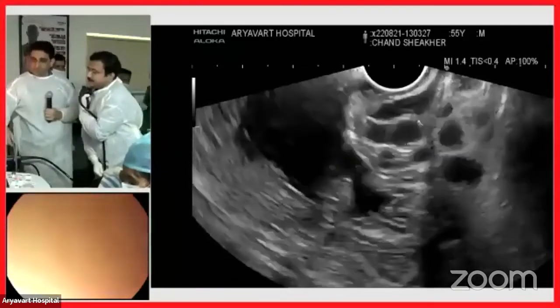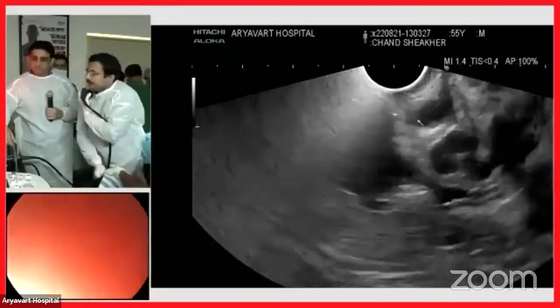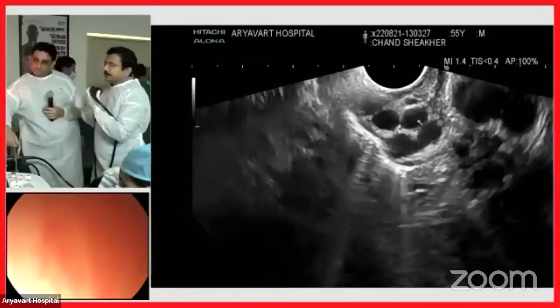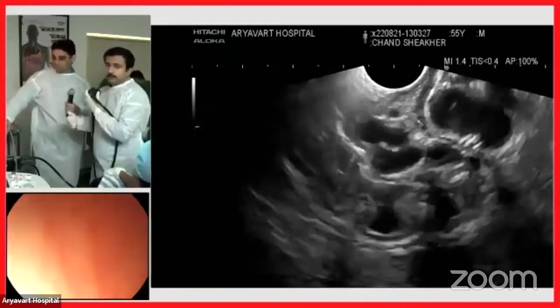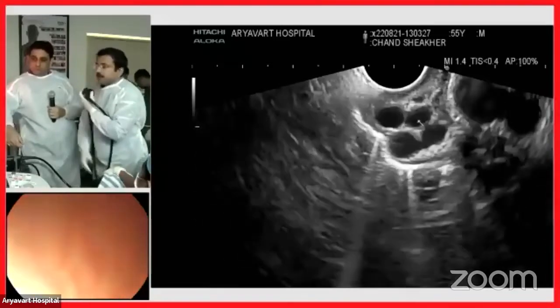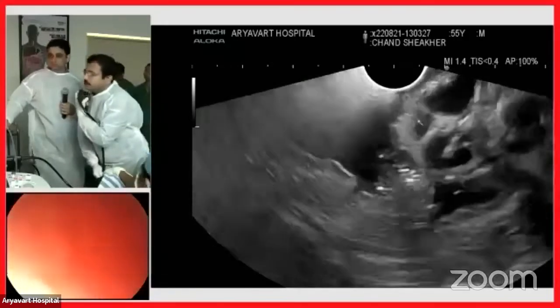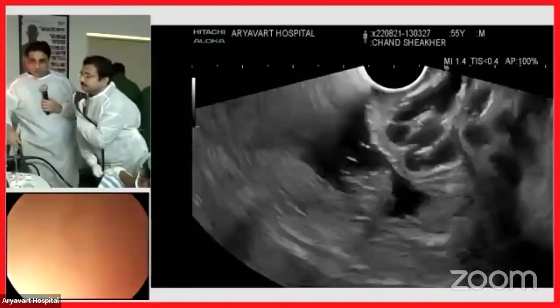The gastric varices coiling concept was first done by the Romero group — they did the first US-guided coiling and glue. The major part of the coil-plus-glue concept was given by Dr. Kenneth Binmoeller, the person who invented the AXIOS stent. The basic concept is: the coil acts as a scaffold, and once you push glue it forms a cast. This has two benefits — the glue does not embolize because the coil holds it together, and the amount of glue required is lower compared to using glue alone.